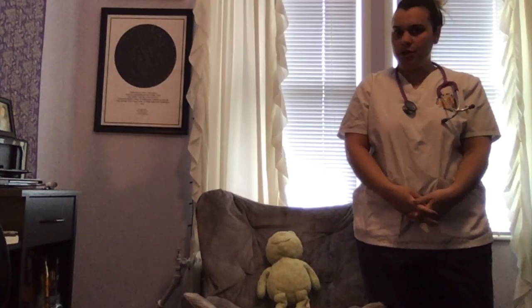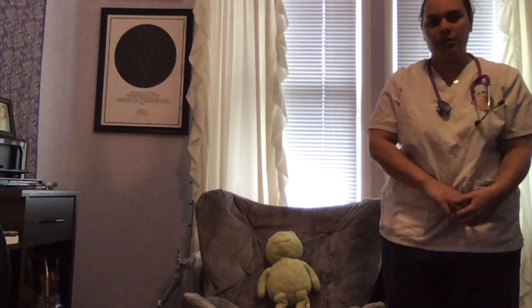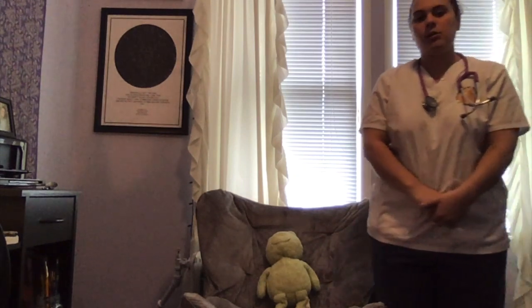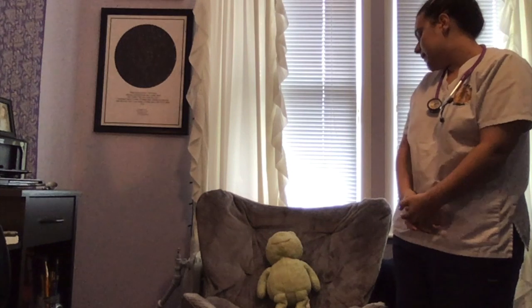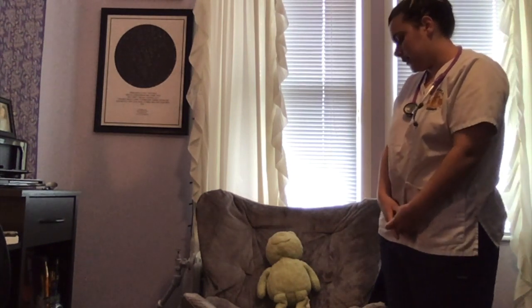Now that the steps of preparing the insulin have been explained, I will now walk into my patient's room and administer the insulin. So I would walk into the room, I would introduce myself to the patient, I would say, "Hi, my name is Michelle and I'm going to be your nurse today. I'm here to give you your insulin."